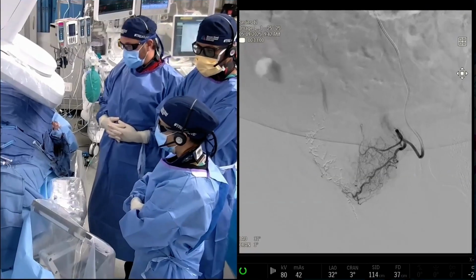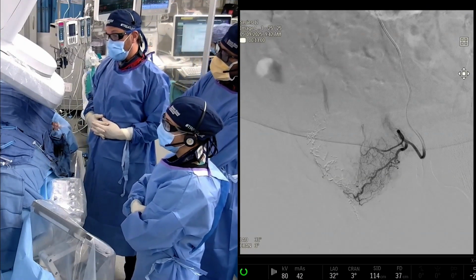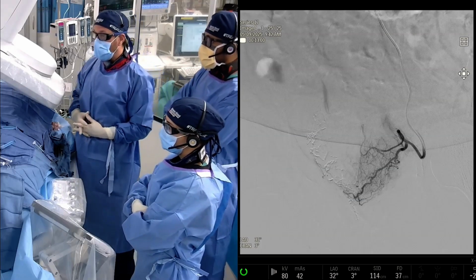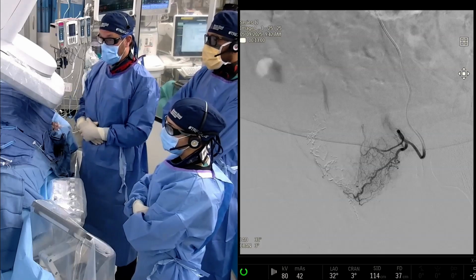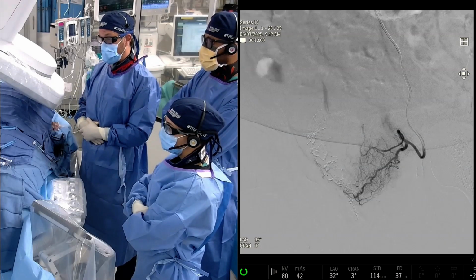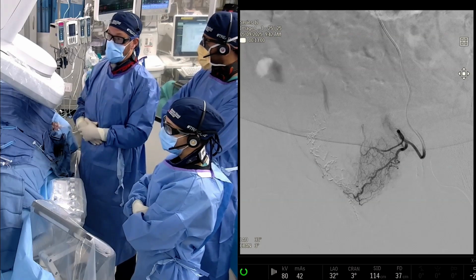Thanks, Art. Sid and I were just talking about whether we should put this catheter a little bit further in. I don't think we need to with a balloon catheter because we know we're going to get both branches. But if we were using an end hole, we would potentially advance it into each of those branches. I don't think that we're going to maneuver this catheter anymore because I think it's in a good spot, and we know we're going to be able to get both of those branches without any non-target here.